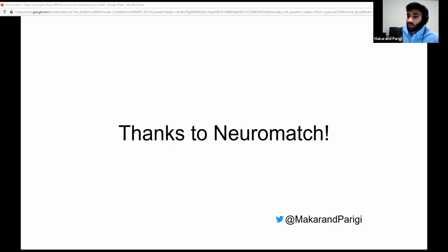Right, so what we used as a metric was the SSIM, which I think was originally intended for regular images, not really medical images. So there isn't really a great metric for automatically evaluating reconstructed images, which is why a lot of these tasks rely on actual radiologists going and looking at the reconstructed images and evaluating them for diagnostic quality. So there really isn't a great automated metric, but SSIM seems to be the most prominent right now.